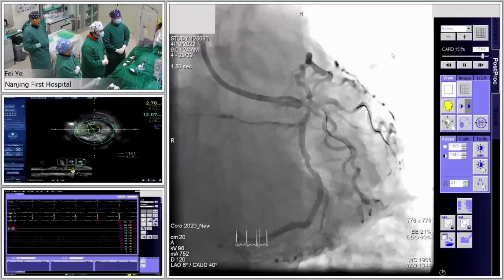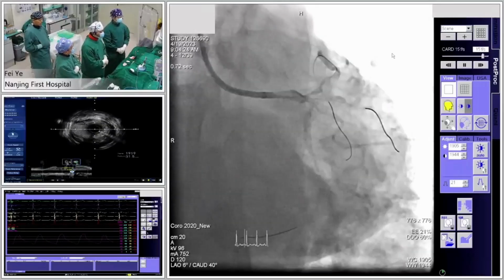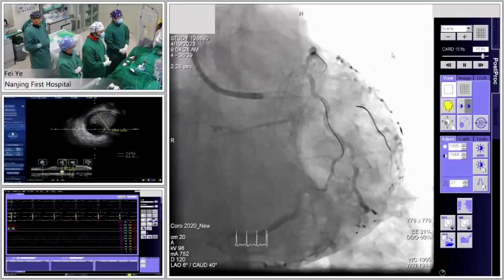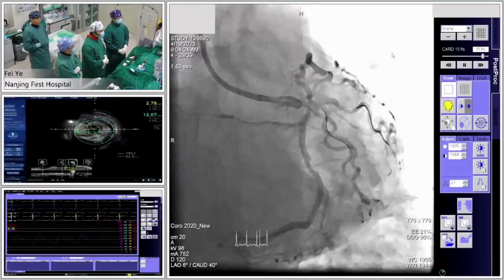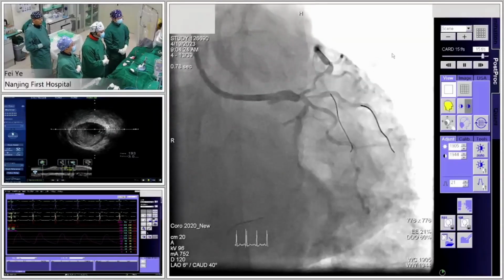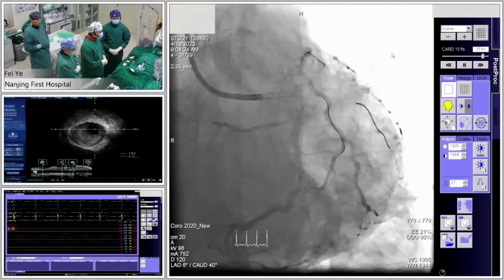On angiography, the left main looks like 5 millimeters in diameter. So I think there is a very wide discrepancy in vessel diameter. In general, if you use a stent crossover from the LAD to the left main, which kind of stent is the best one?